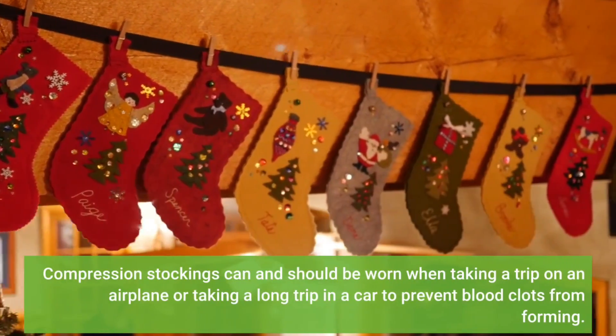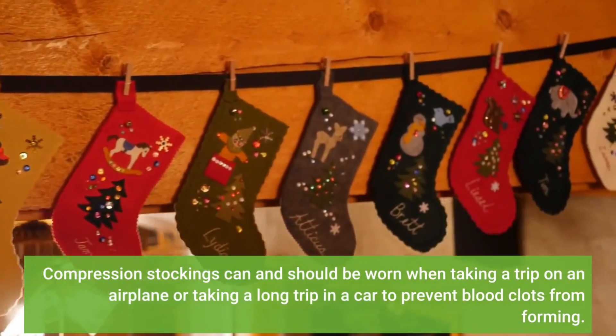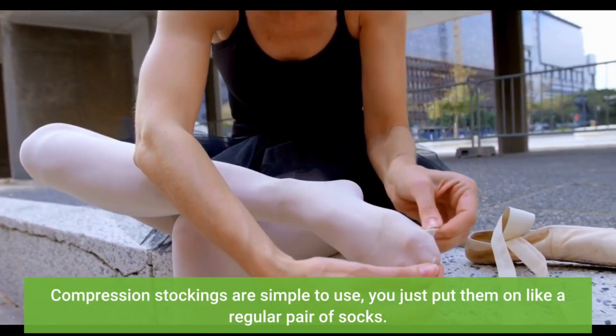Compression stockings can and should be worn when taking a trip on an airplane or taking a long trip in a car to prevent blood clots from forming. Compression stockings are simple to use — you just put them on like a regular pair of socks.